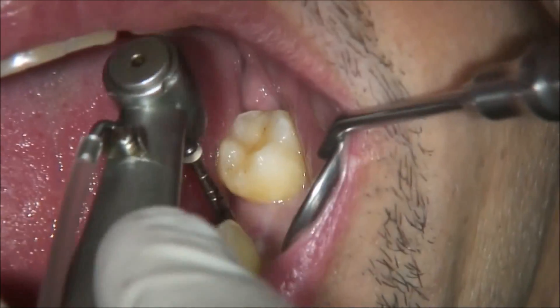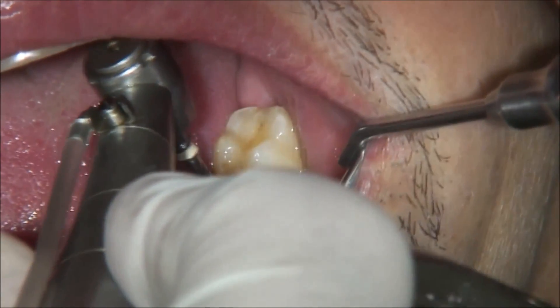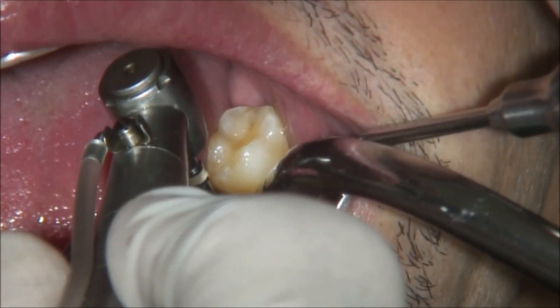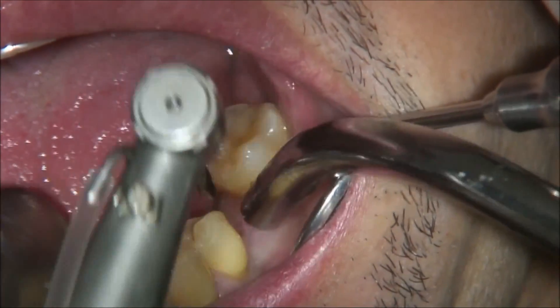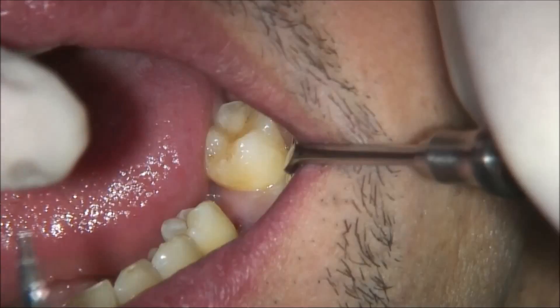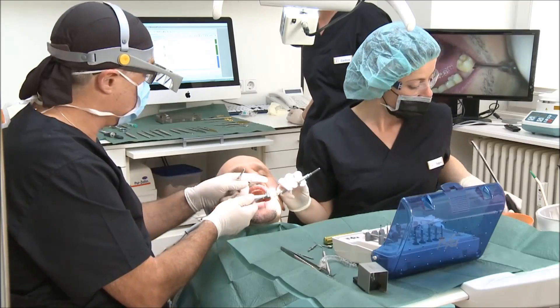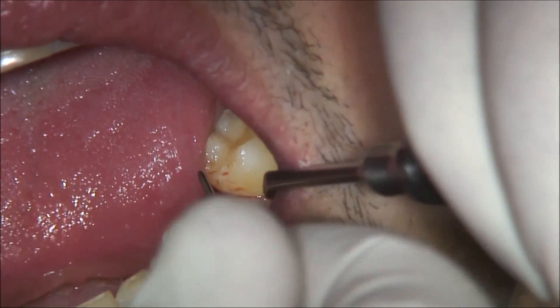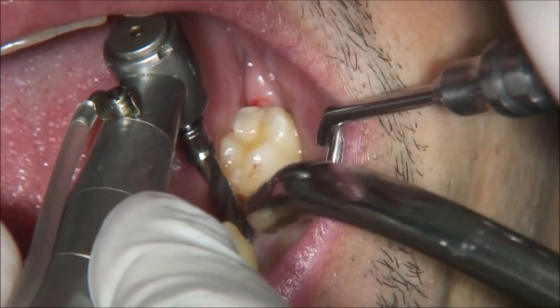After creating the 1.5 mm cavity, the next step will be using the 2.0 pilot drill of the BHI system. We go to the final length and final depth for the 10 mm implant. The second step will be a telescopic drill, which will create a cavity for the 3.7 mm implant.